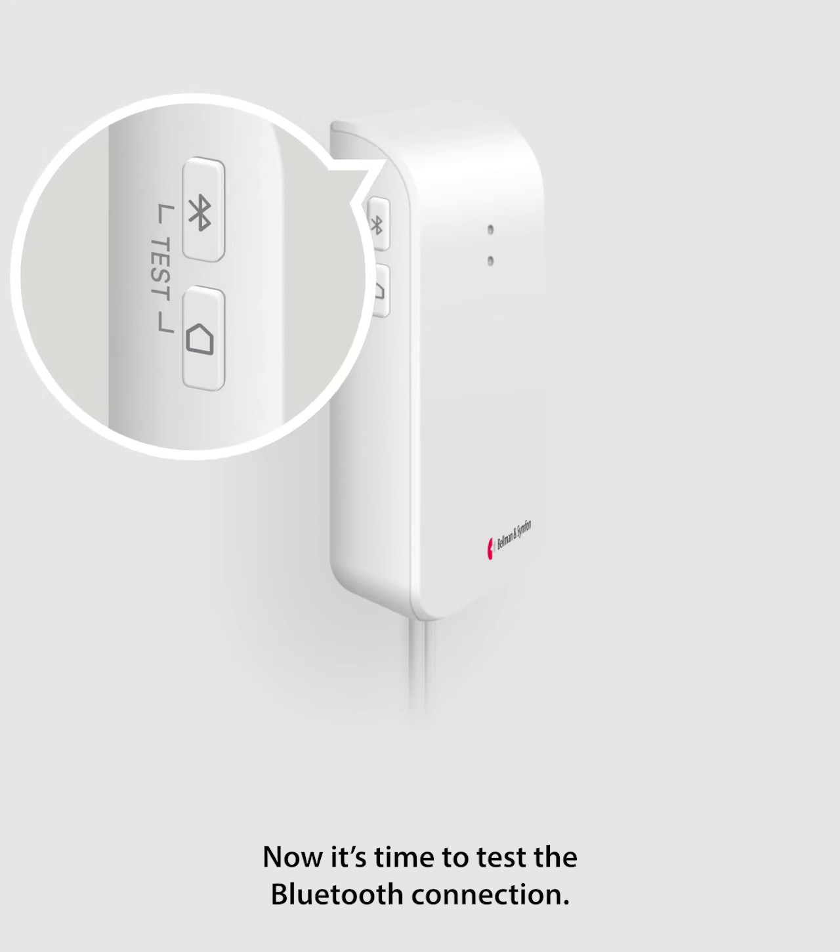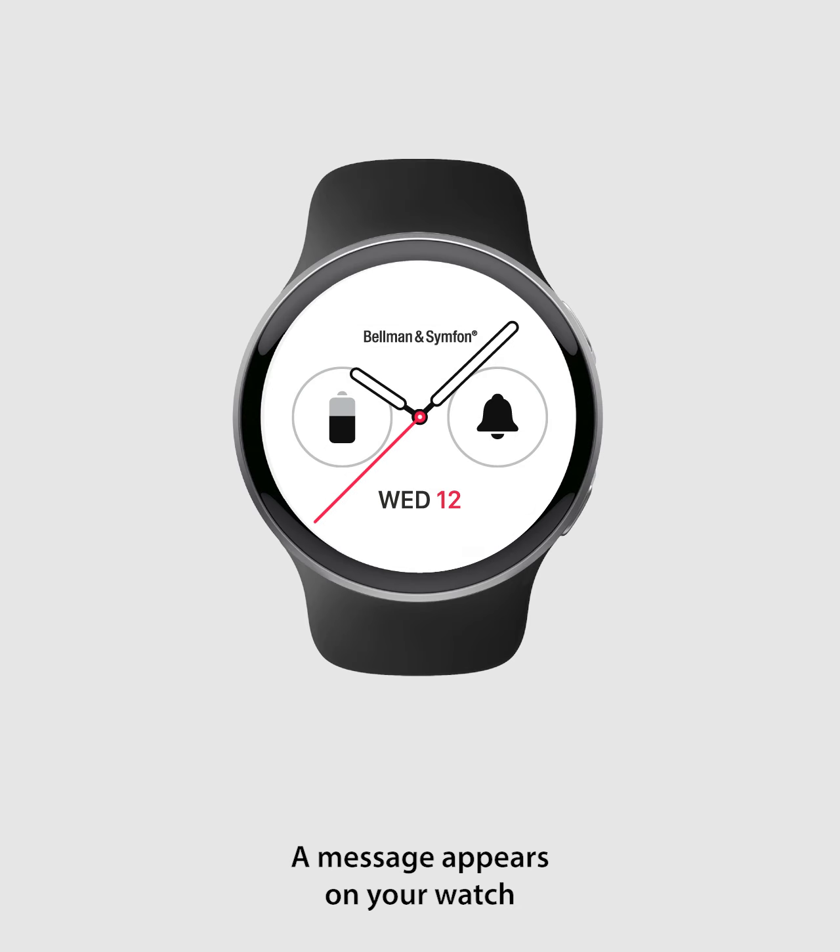Connect the USB cable to the power adapter and plug it into the power outlet. Now it's time to test the Bluetooth connection. Press the top test button on the bridge. A message appears on your watch to confirm that it's connected.